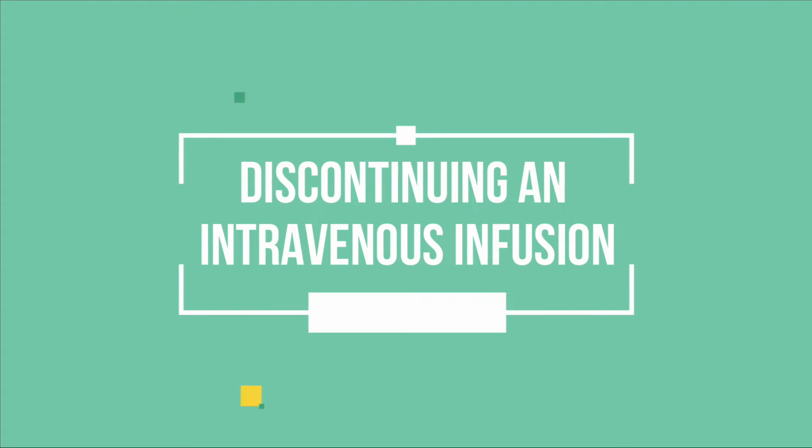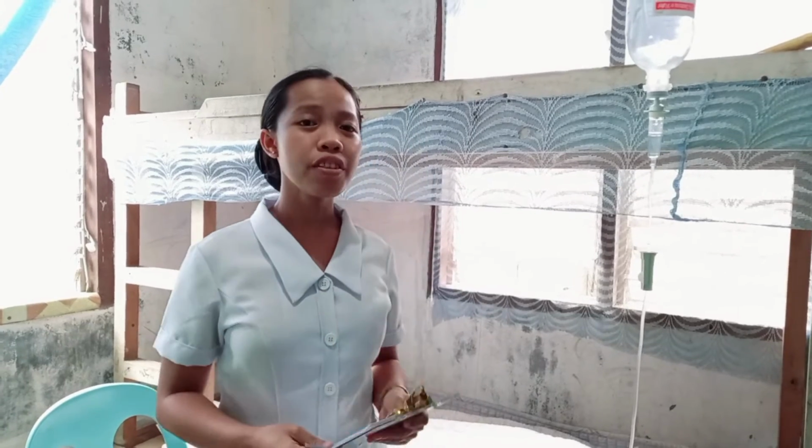And lastly, we will monitor the IV solution of the patient at least every 30 minutes to check the flow rate and to observe for any infiltration and other untoward symptoms. When the patient no longer needs IV fluid, IV medication, or access for emergency drug, the cannula is removed. However, a special precaution must be followed when removing the IV cannula because there is almost always a slight amount of bleeding. So first, we need to check the physician's order for discontinuing the IVF.